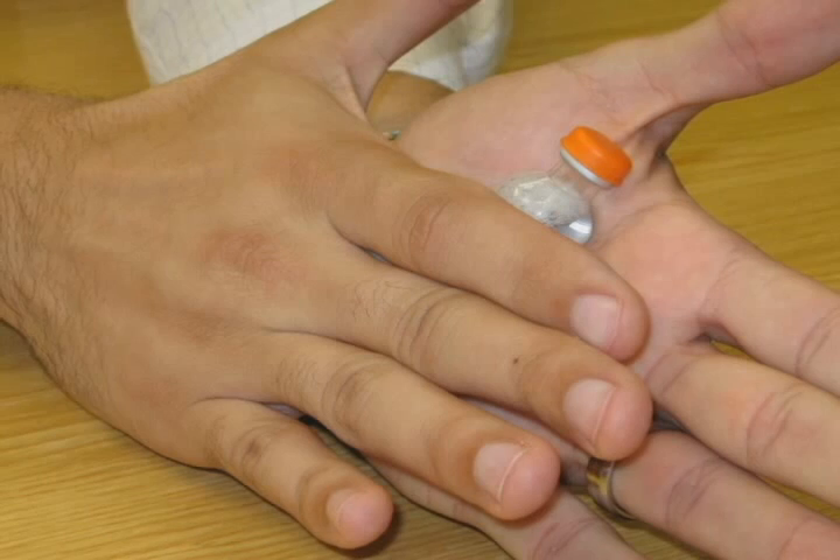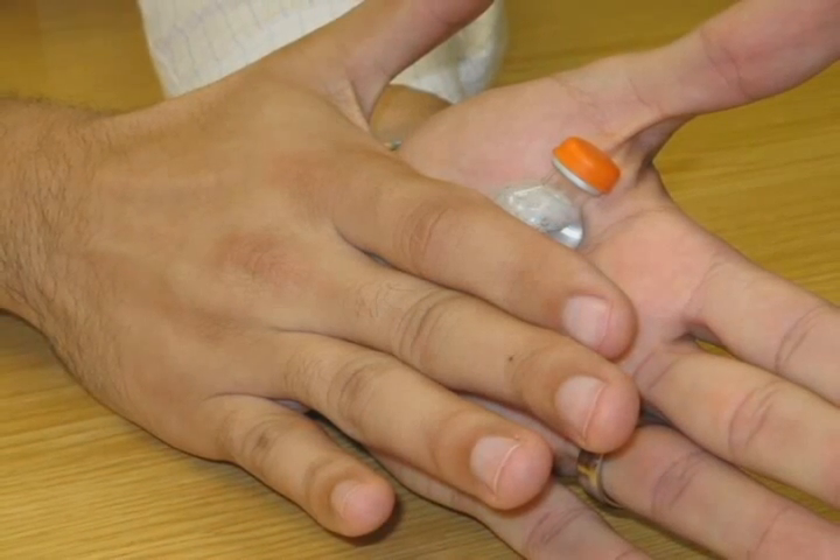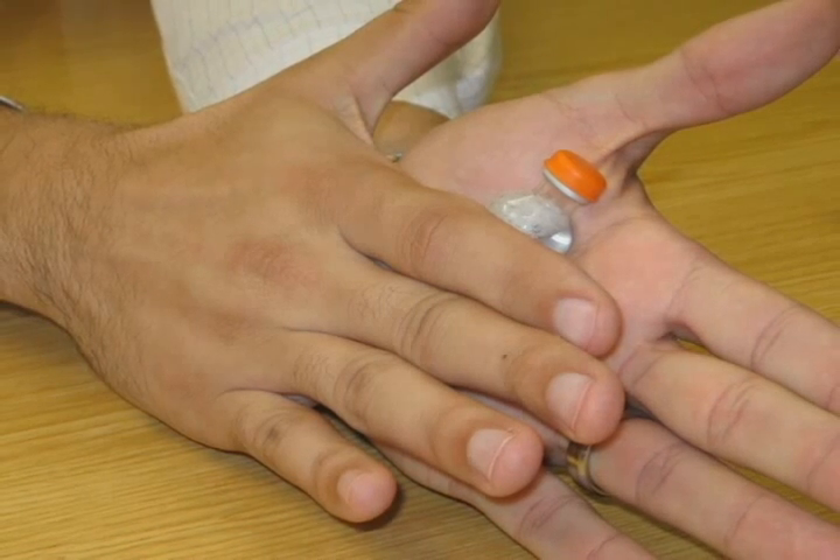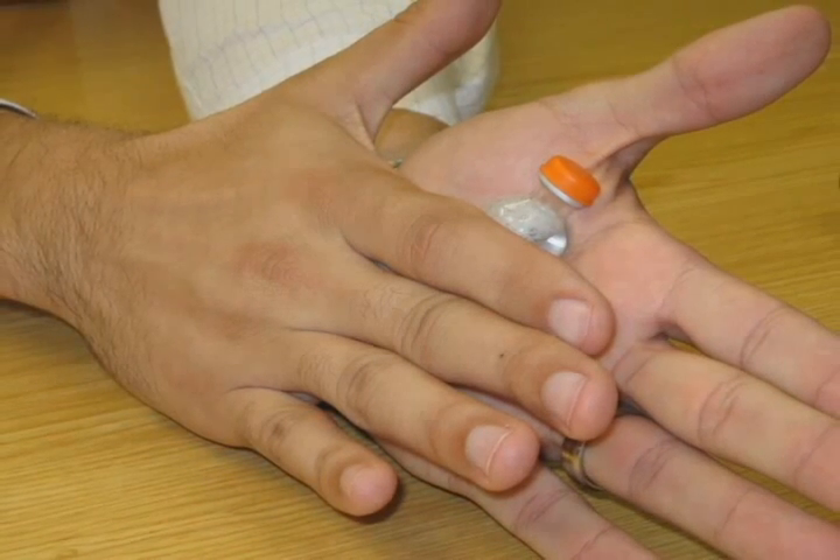Once your insulin has been inspected, if you have a cloudy type of insulin, gently mix it by rolling it back and forth between your hands. Do not shake the insulin. If your insulin is clear, you do not need to do this.